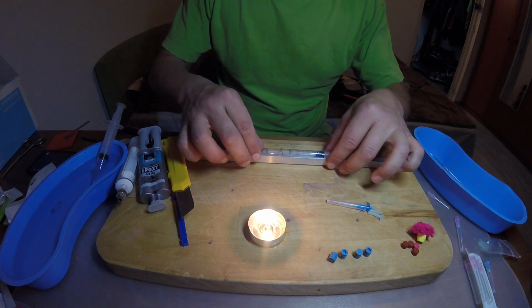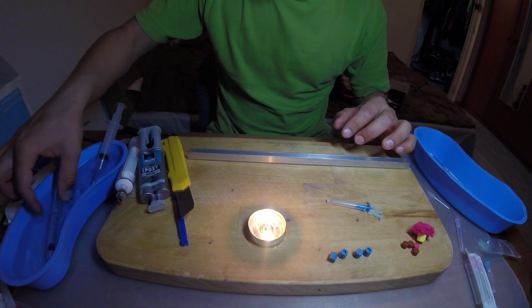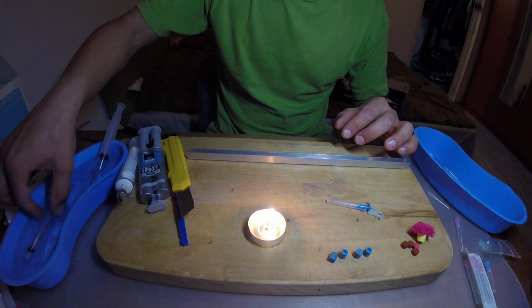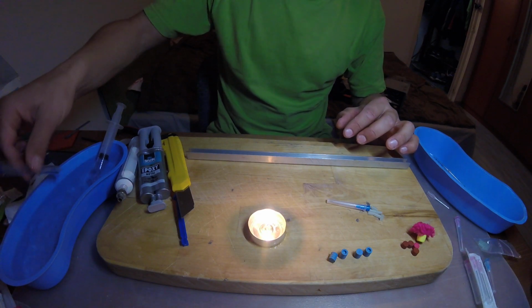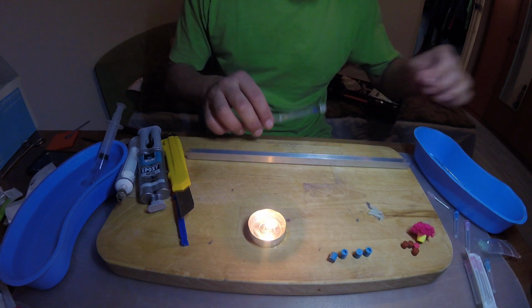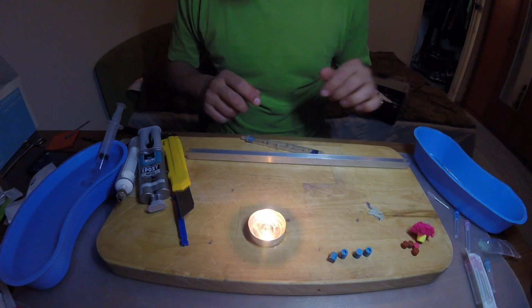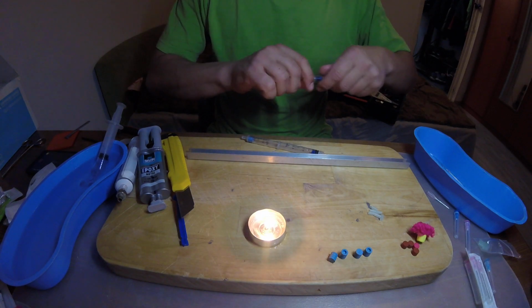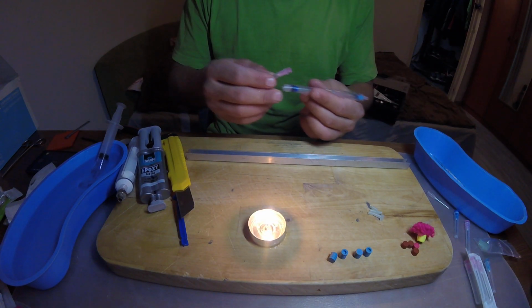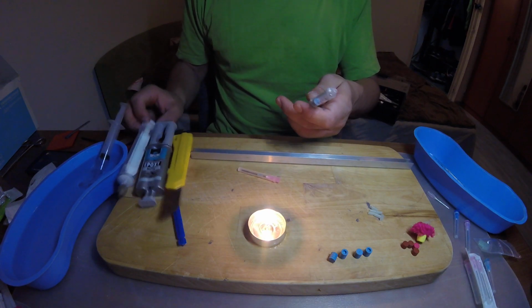and then put in some water to get strong, and now we can test if they work. I'm gonna use one of my needles that I made the other day. This should work. Let's see.